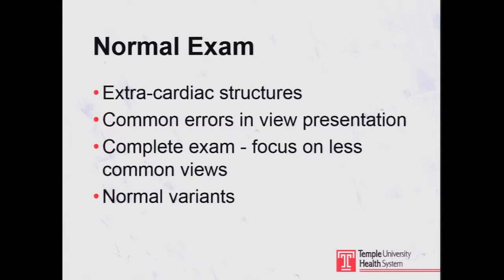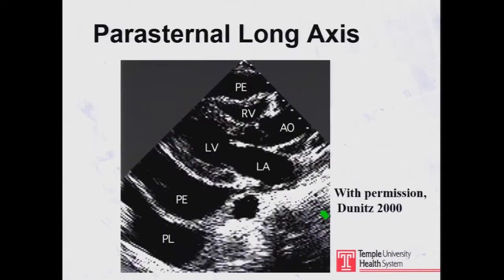I'm going to talk about the normal exam and specifically focus on extracardiac structures and common errors in view presentations. We're going to talk about the complete exam, but focus on the less common views and also normal variants.